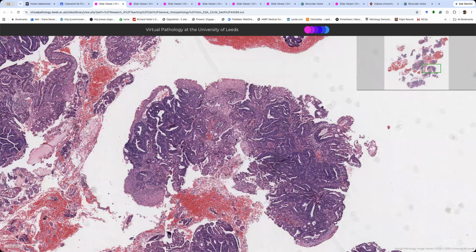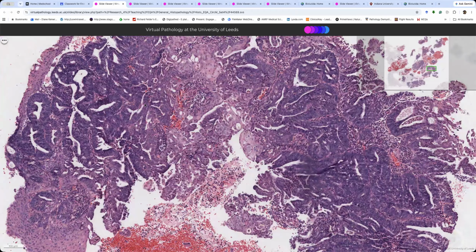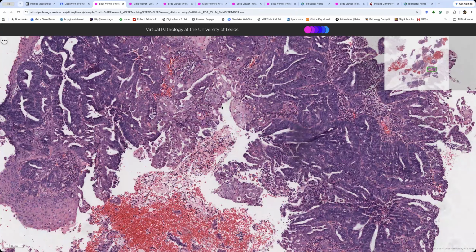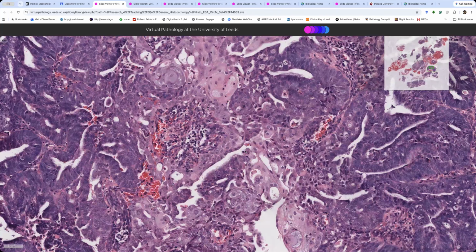The other thing that will tell us that it's endometrioid is this stuff. Right, we've got squamous and morular metaplasia. What percentage of serous carcinomas have squamous and morular metaplasia? 0, 2, 5, or 10%? Adam said 0, 0, 0, 0. As soon as we see this, high five, not serous. Okay. So squamous metaplasia indicates that this is in fact endometrioid.